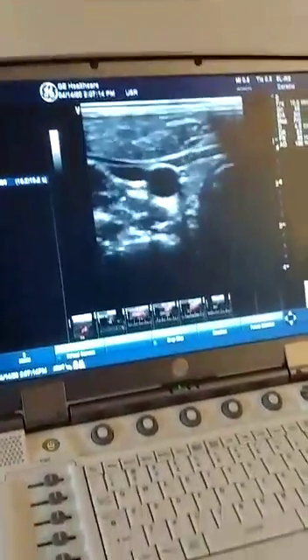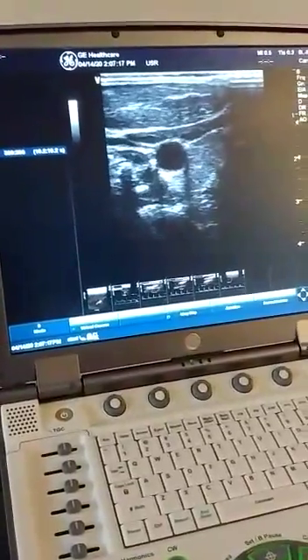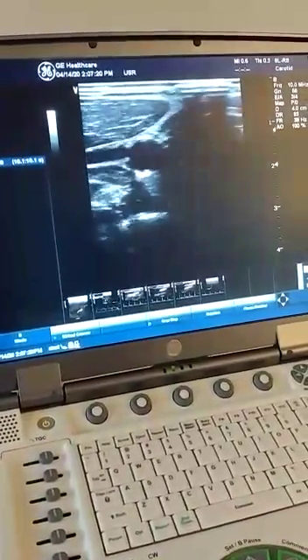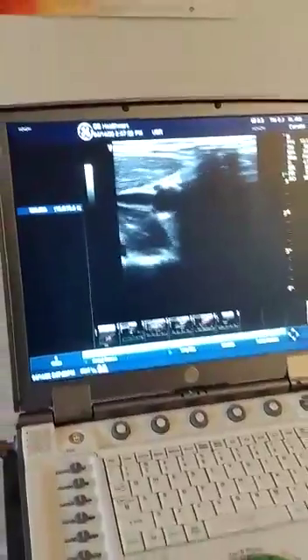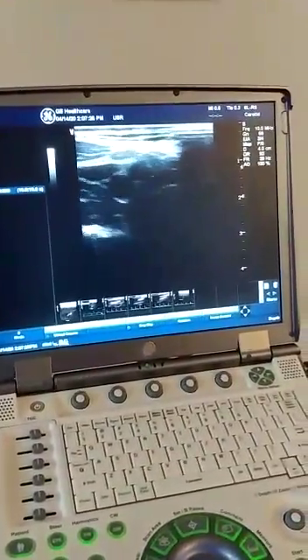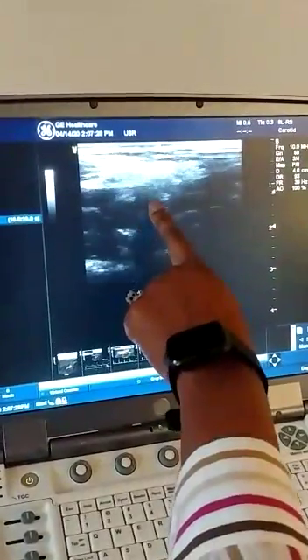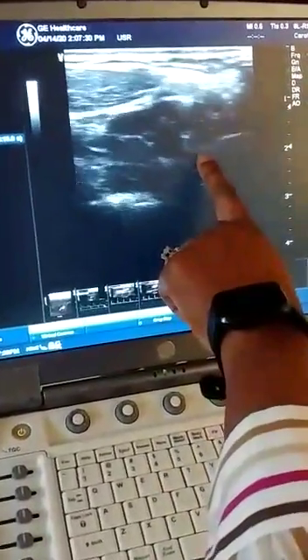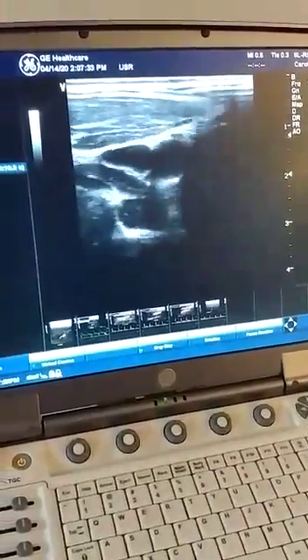I'm scanning towards the head, and you're right about the mid-level of the common carotid artery. Further up is your distal segment, and as you go further up you would see that it splits into your ICA and your ECA. We'll go into that in a second.